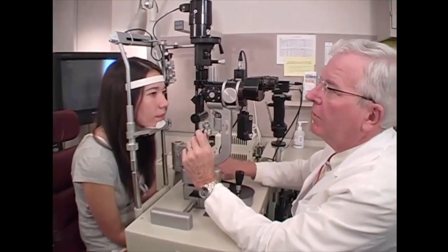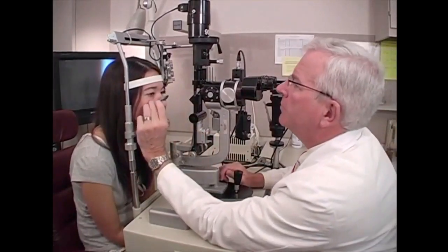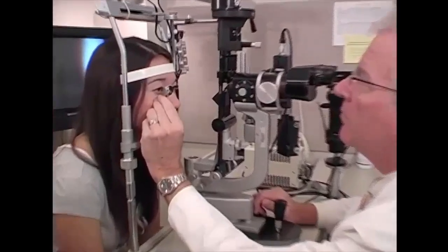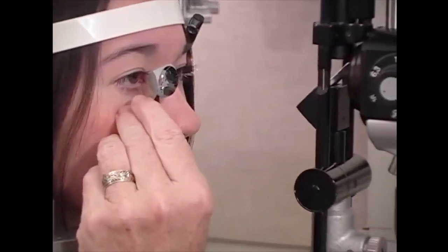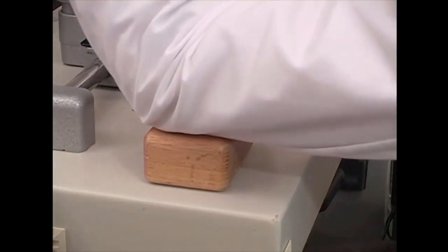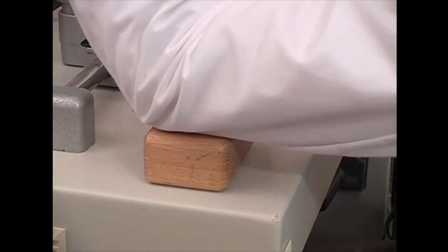I have the patient comfortable. I tell them that the lens will be close to their eye but won't hurt their eye, and they'll feel it touching their eyelid. You can see that my fingers are braced so I can keep up with her wherever she goes. And my elbow is sitting on the table. As an examiner, if you have shorter arms, you should put your arms on some sort of a block, because if the elbow is waving around, it's just one more thing to worry about.